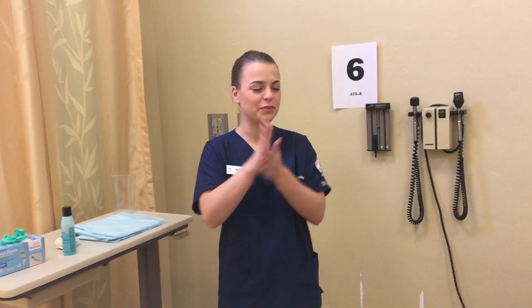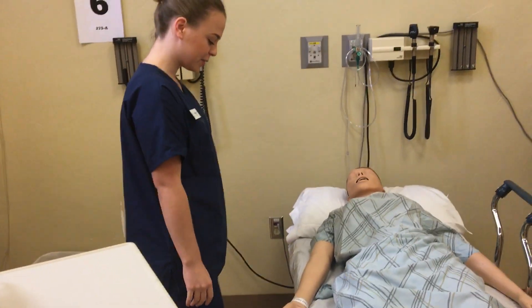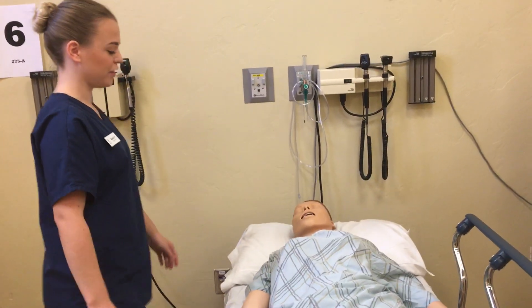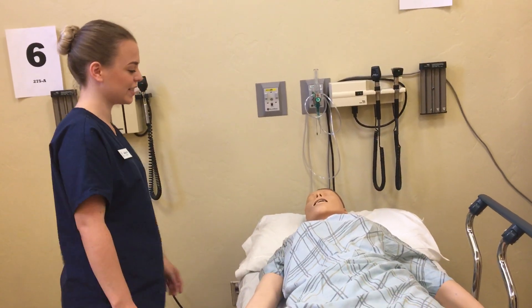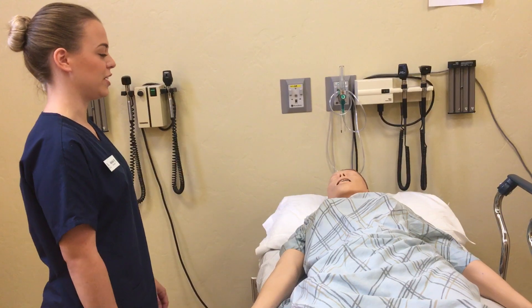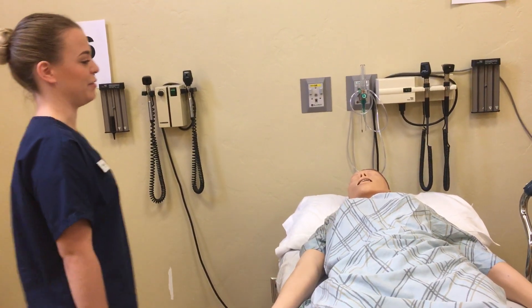Simulating that I'm just now walking into the room: Hi, good morning, my name is Allie and I'm going to be your nurse today. Can I start off by having you tell me your full name and date of birth? Nicole Blackburn, 2-10-1998. Okay, that's what I see on your armband. I've checked your medical records and your chart, and your physician has put in an order for me to insert a Foley catheter today. Are you familiar with what that is? No. All it is is small tubing that's going to be inserted up your penis through the urethra into your bladder, and it just helps us drain and monitor your urine. Can you tell me if you have any allergies to latex, iodine, or shellfish? No. Okay, then we're okay to start.